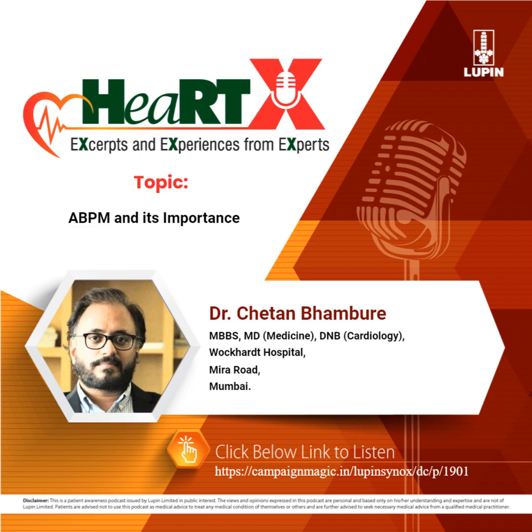The nighttime readings are available. There is measurement in real life settings. There are additional prognostic BP phenotypes which are available. And there is abundant information from a single measurement session, including short-term blood pressure variability. The only disadvantage is it's slightly expensive and sometimes the availability is limited and it can be uncomfortable.